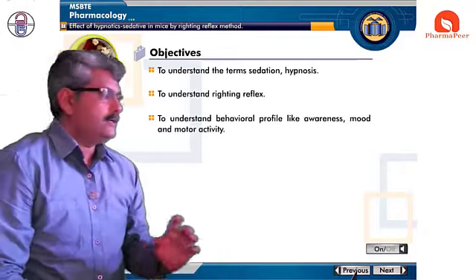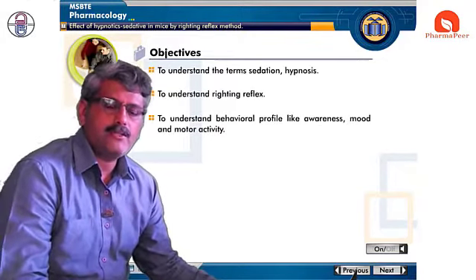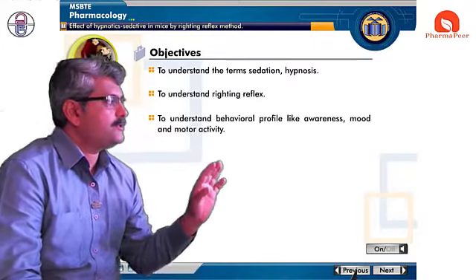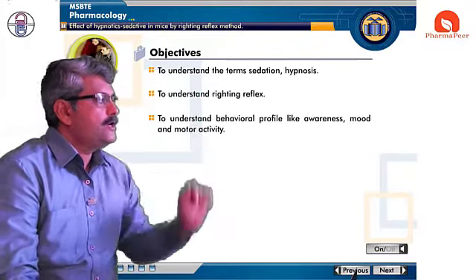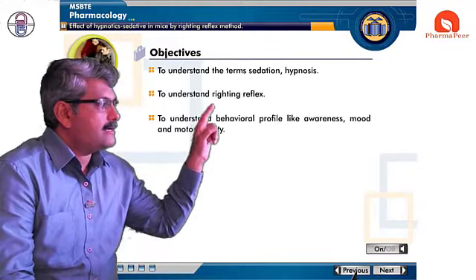So with the aim of this experiment, we should understand the objectives of today's experiment.